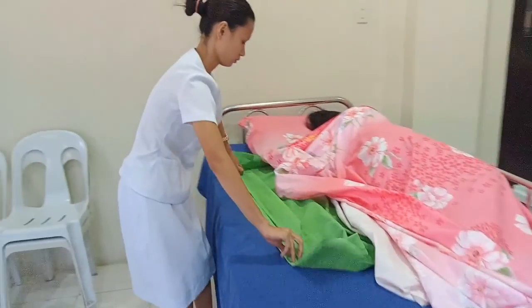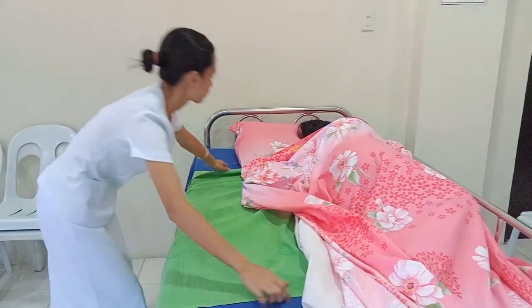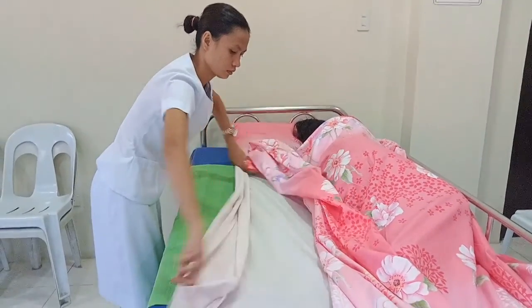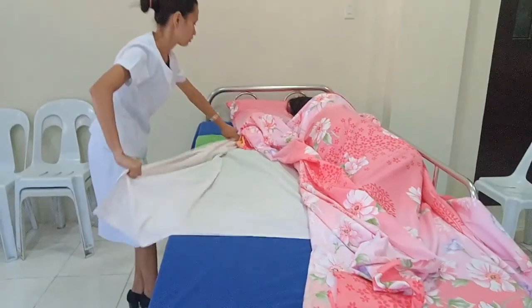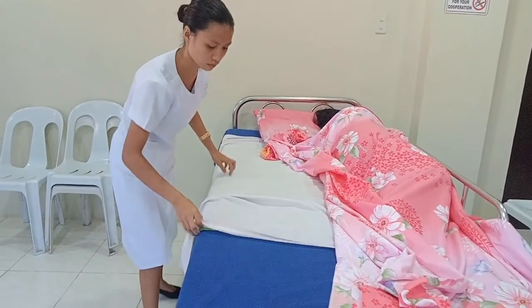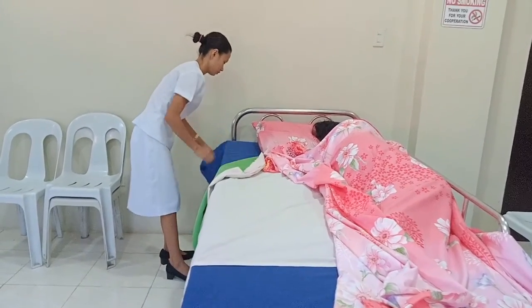Unfold the draw sheet fan-folded at the center of the bed and pull it tightly with both hands. Pull the sheet in 3 divisions. Face the side of the bed to pull the middle division. Face the far top corner to pull the bottom division.